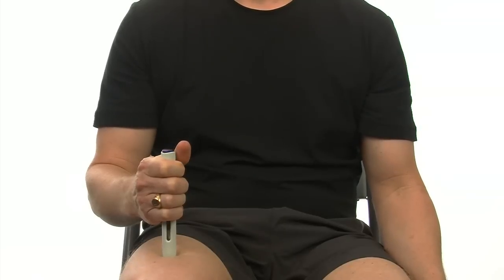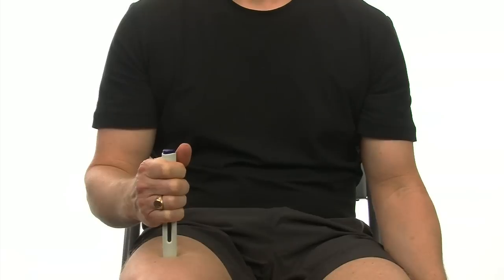Press the activator button on the auto-injector to activate the device. The injector will now inject the medicine under the skin. Some auto-injectors will click when the injection is finished. However, it's best to count to 15 slowly: 1-1000, 2-1000, 3-1000, etc.